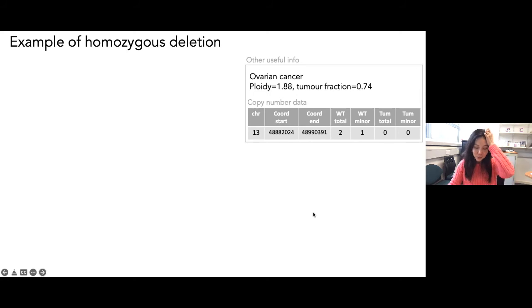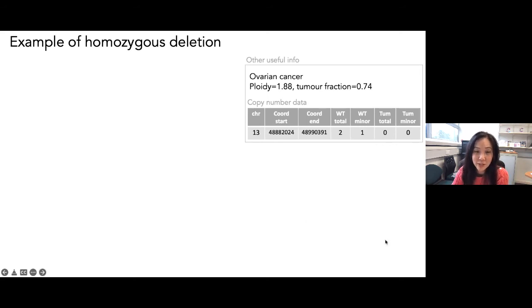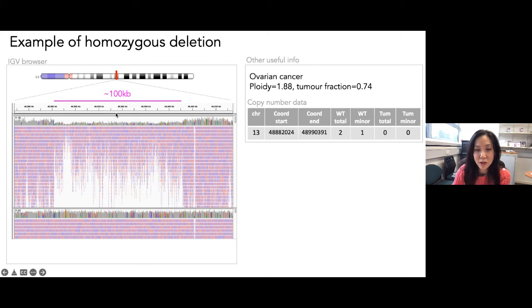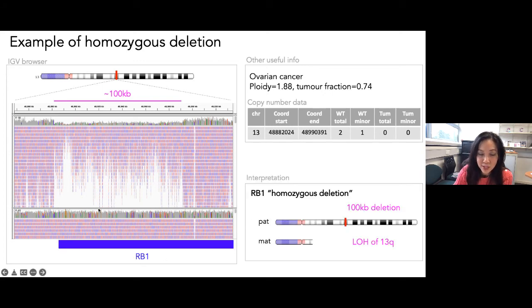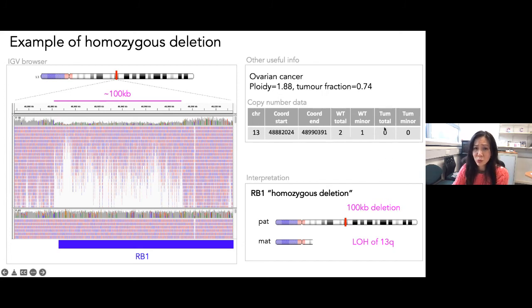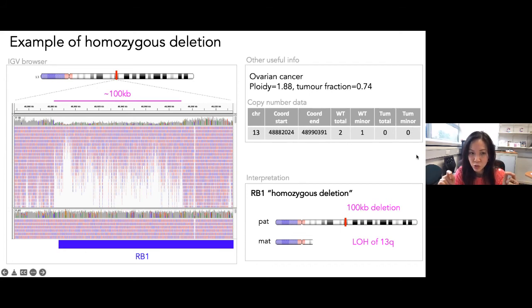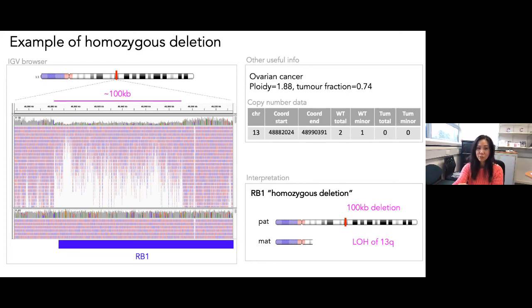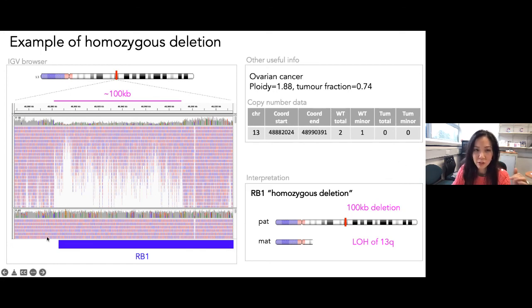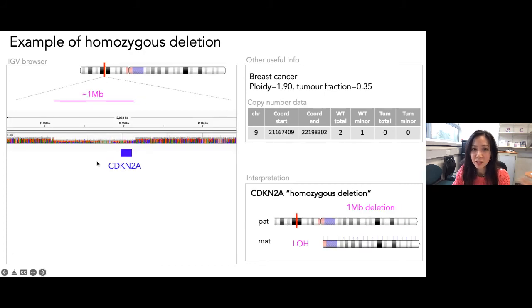Homozygous deletions are large chunks of the genome completely missing from both alleles: total copy number zero, minor allele zero. These tend to occur in tumor suppressor genes. An example is an RB1 homozygous deletion in ovarian cancer. A good decision support tool will highlight all 0-0 copy number regions. If a homozygous deletion hits RB1, PTEN, or CDKN2A, it must be reported — but if it hits a region with no genes, it may be irrelevant.